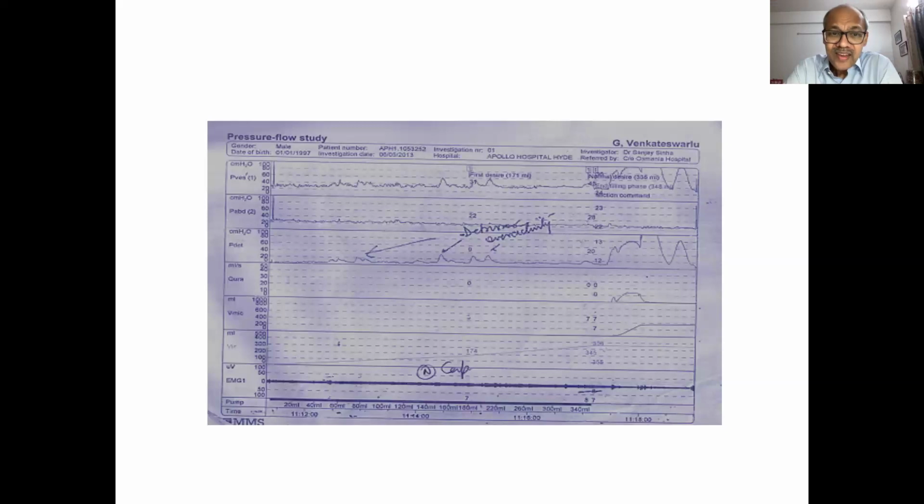Right. So this is a slightly difficult situation. Understanding what is happening in this patient is easier if the patient is not oliguric. So if this patient has come with end-stage kidney disease and he's oligoanuric, then interpreting the urodynamics becomes more challenging. You can't do non-invasive testing to get an initial picture very well and so on. So there are challenges there. If you see the presentation, clearly this patient seems to have had storage symptoms.